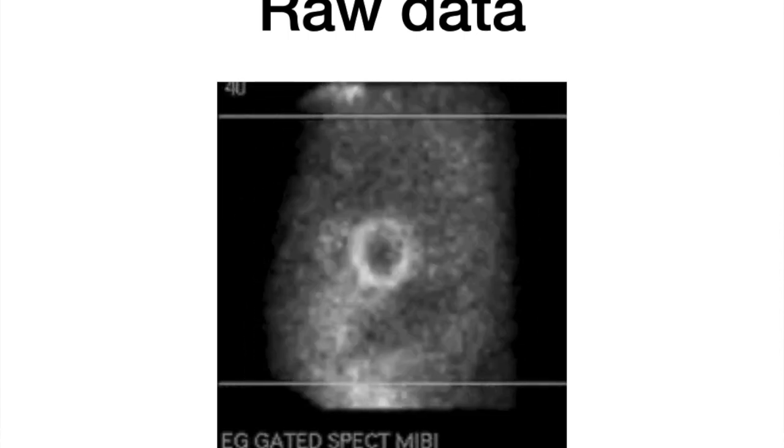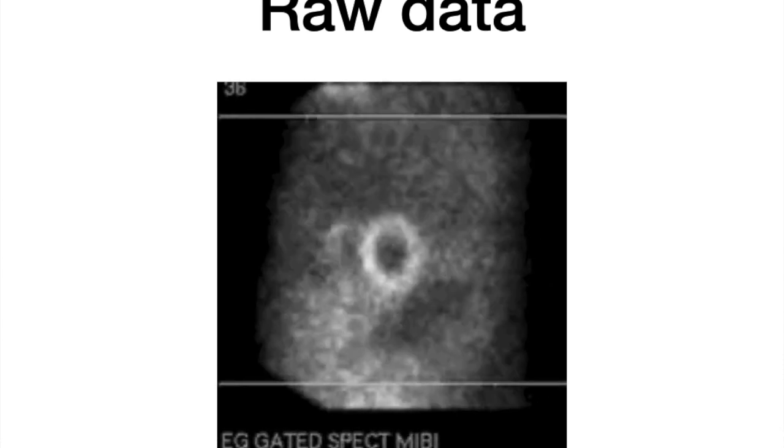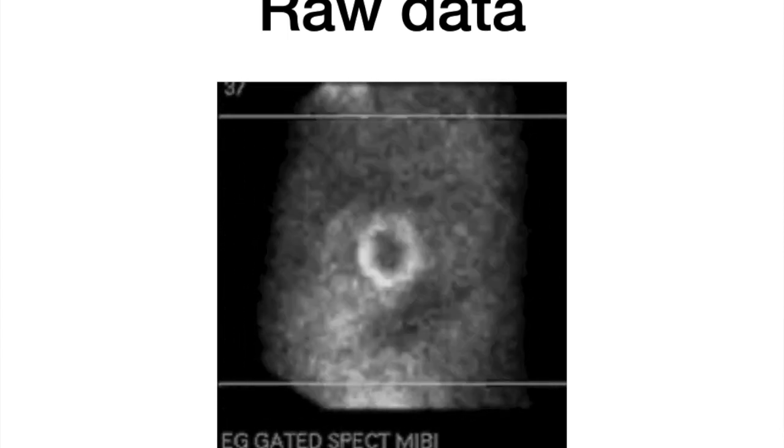You may get lung uptake, for instance, if you push the patient into heart failure during the stress imaging, which is a poor prognostic sign. And also here you can see the effect of free technetium in the salivary glands. But review of the raw data is a possibility to review for attenuation and to review for patient motion, and also this extracardiac activity and its proximity to the heart, which may all cause problems.